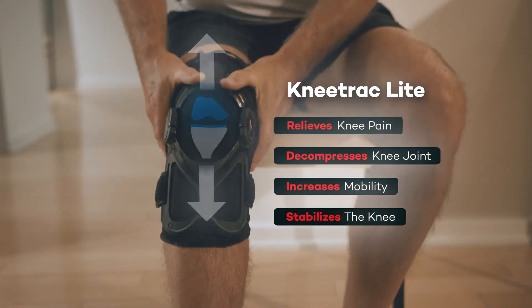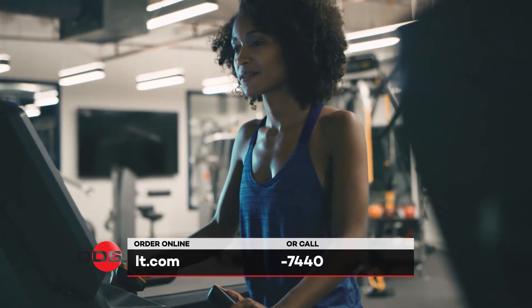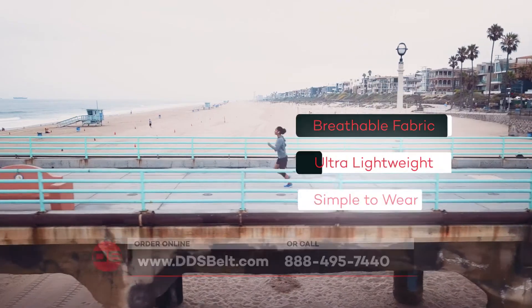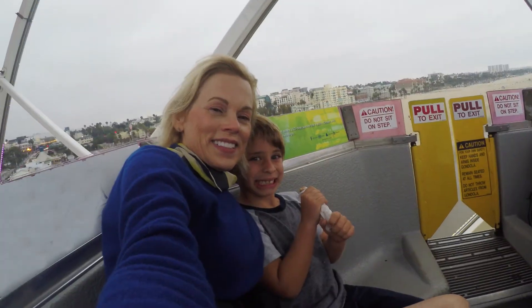Made out of breathable lightweight fabric, the G2 Belt and the Knee Track Lite can be worn discreetly under clothes, allowing you to do the things you love, resume the activities that made you strong, and revive the relationships that made you happy.